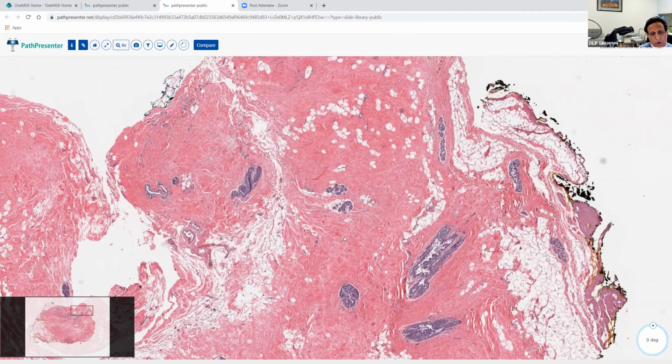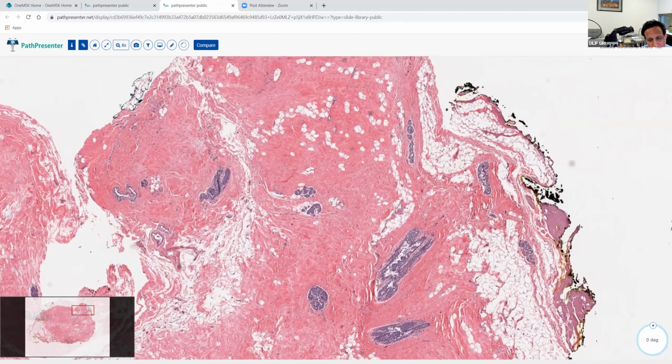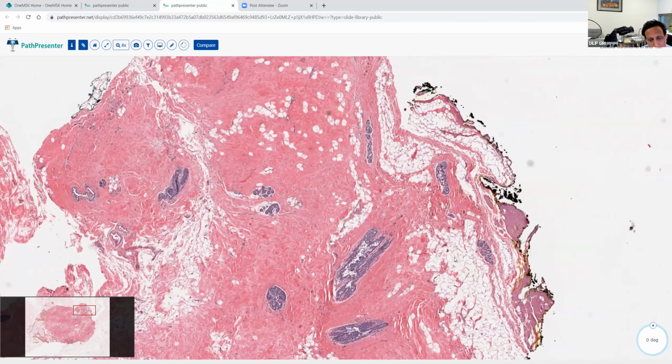And the problem with invasive lobular carcinoma is that the cells, as we know, right? They don't form big clusters or clumps. They can be very single cells and very low grade, right? And when they sit between the fat adipocytes, they may just mimic, like maybe there is some fat necrosis or something like that. But in fact, that may be the subtlest manifestation of invasive carcinoma.